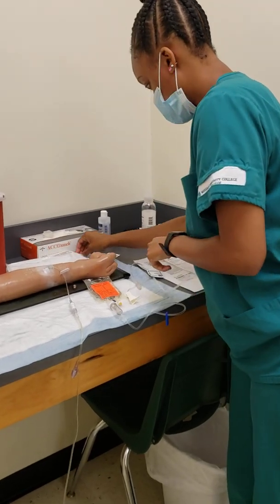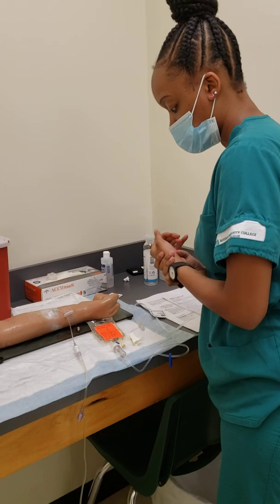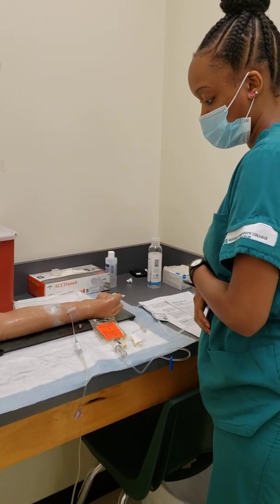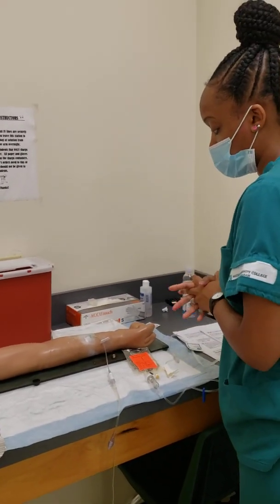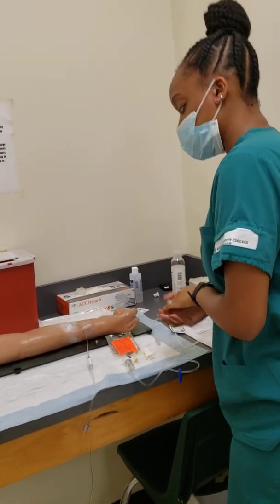Okay. All right, knock knock. Hello, my name is Tiana. I'm going to be your student nurse for today. And today I'm going to be giving you some medication, IV piggyback, okay? Can you tell me your name and your date of birth? Okay, she tells me her name and date of birth. Can you tell me if you're allergic to anything? Okay, she's not allergic to anything.